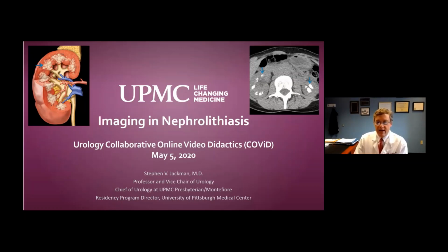So with that said, I would like to discuss imaging in nephrolithiasis, and the whole goal is to make this practical, really aimed at a junior resident level, things we might discuss on rounds, or as we're looking at some x-rays, but hopefully it'll also have enough useful tidbits that chief residents will learn something as well. Kidney stones are such a bread and butter to us that a lot of times we don't stop and think about what we're doing. And so again, today we're going to stop, examine, think about things a little bit, and hopefully at the end I can answer some questions if you have other ways to think about it.